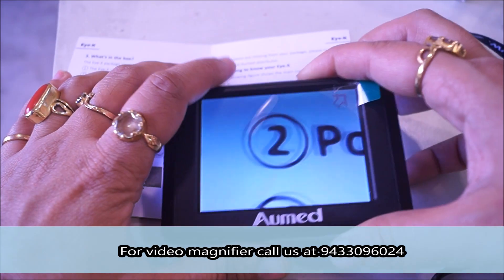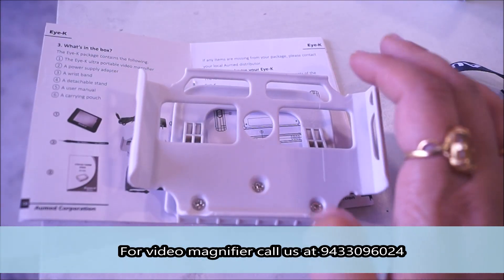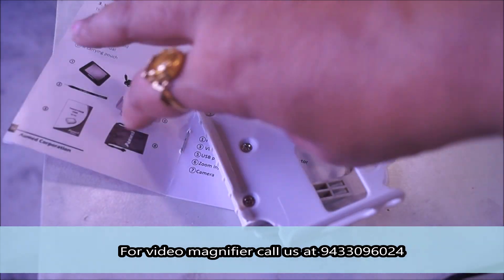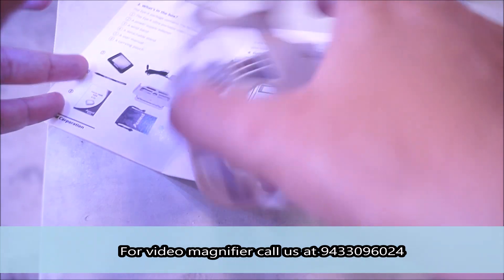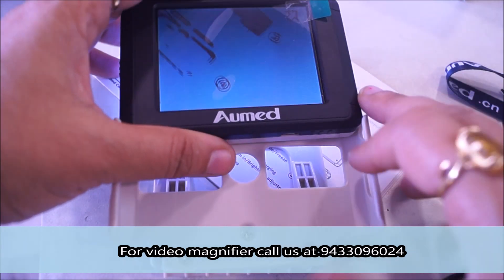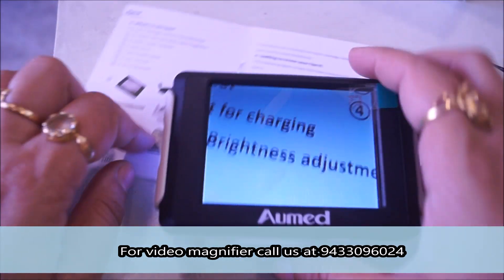Apart from using it in hand, you also get a stand with this. On the stand you can fit the magnifier. Let me show you how to fit it — you can just simply slide it in, and it is done.